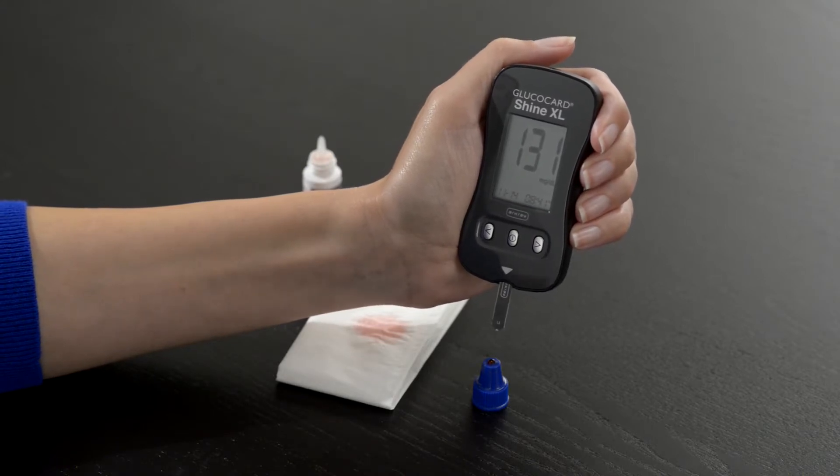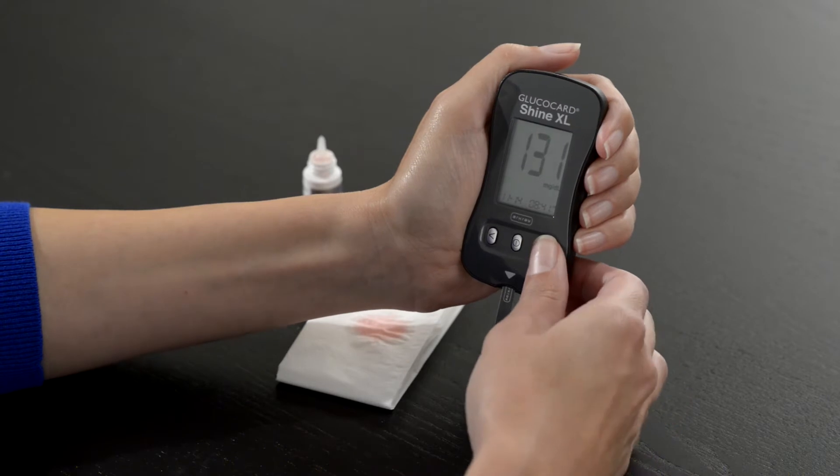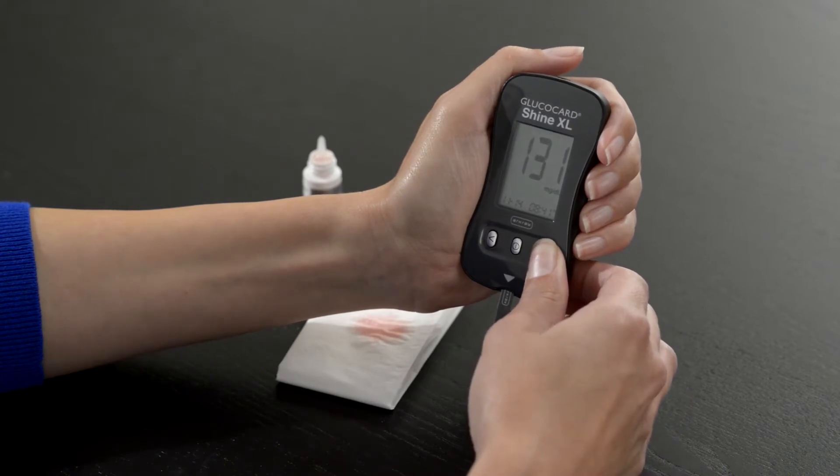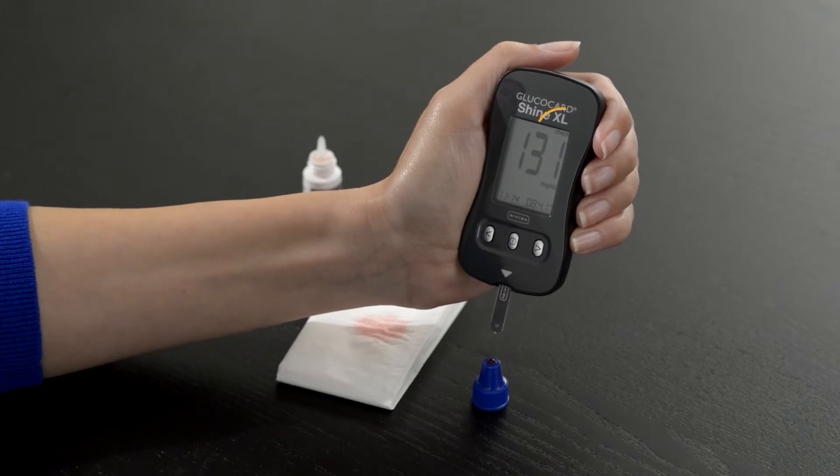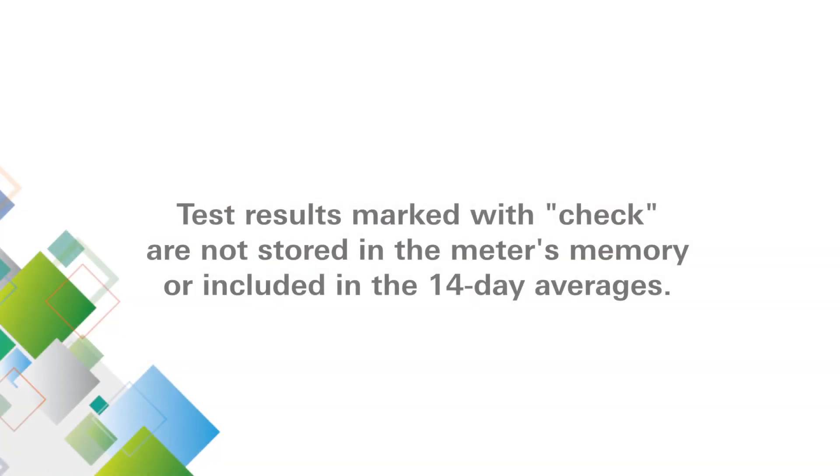To mark this result as a control solution test, press and hold down the right arrow button for three seconds until check appears on the display. Test results marked with check are not stored in the meter's memory or included in the 14-day averages.